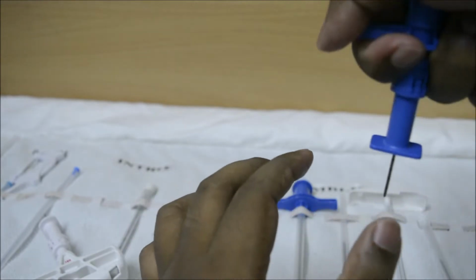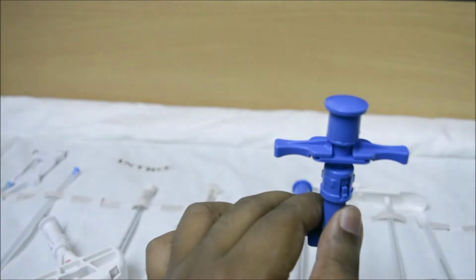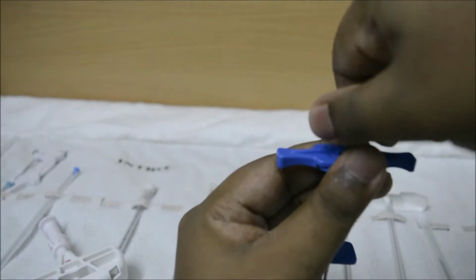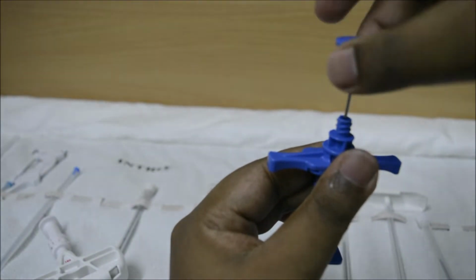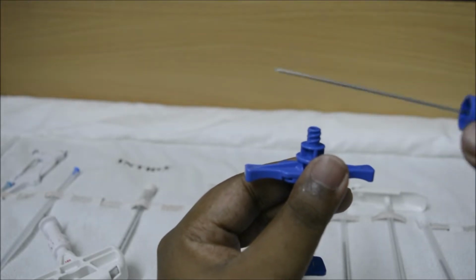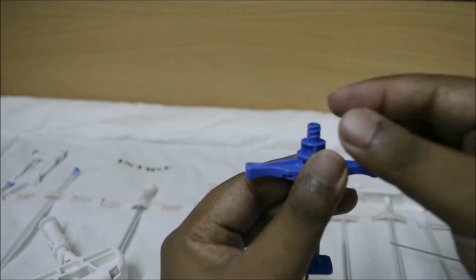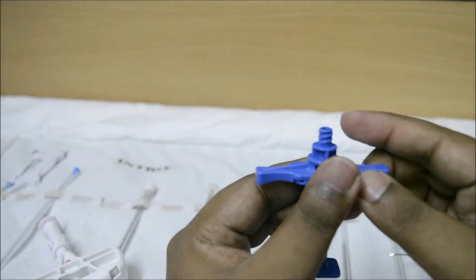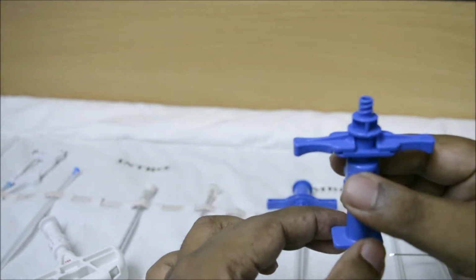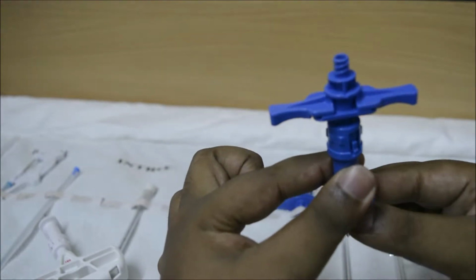So now the needle is inserted. After the needle is inserted, this small smart locking system, this cap, is opened. The cap is attached to the part called the stylet. The stylet is removed. Now as you can see, the top part has a lock system. It is called Luer lock. Now the needle is already inside the patient's body and it is upright like this.